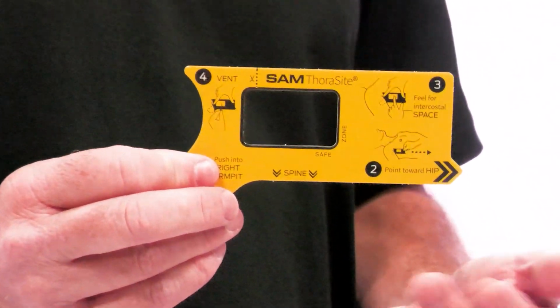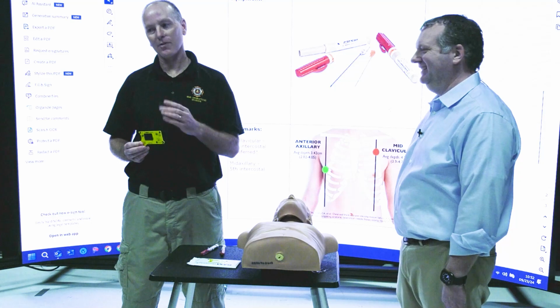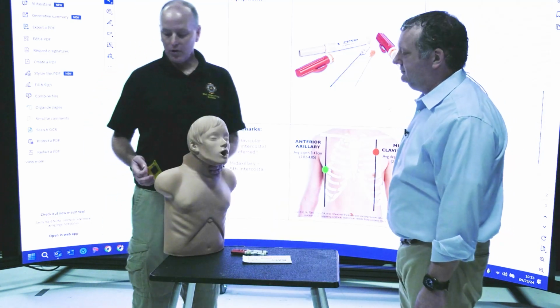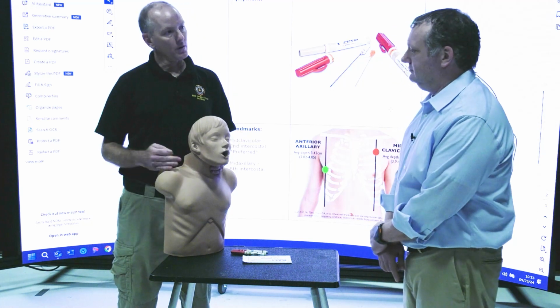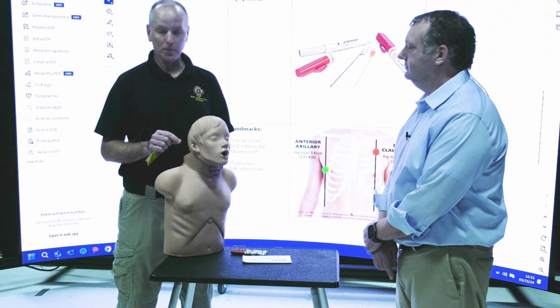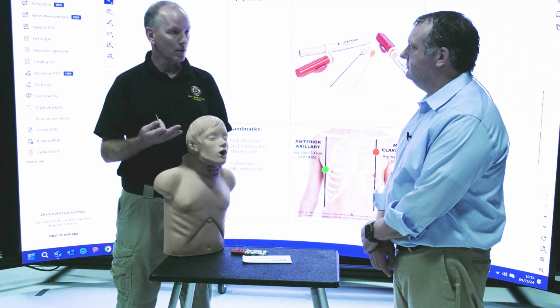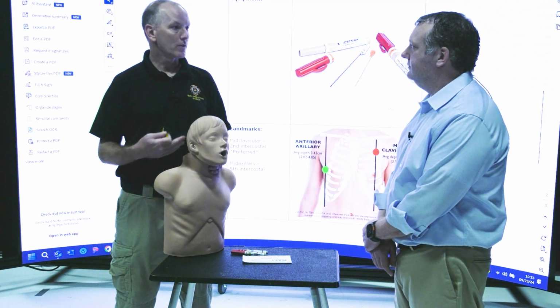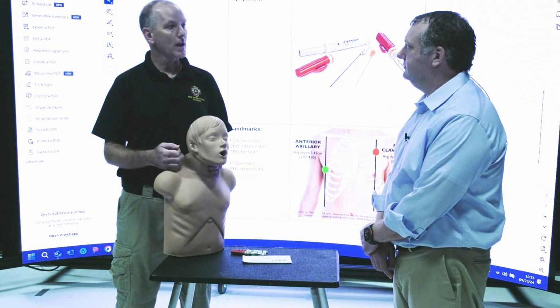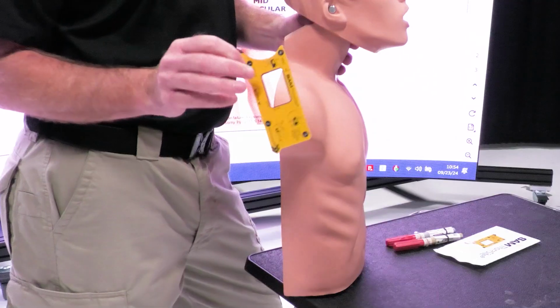We'll show you on a mannequin. We'll show you on me, not decompressing me, but we'll show you how simple it is. It's all about the hip and the armpit. So if you do decide to do the lateral approach, I know the protocol says you're going to have to document very well why you decided to do the lateral approach. So just remember that. If the patient needs it and they qualify, with JVD and completely absent breath sounds, and you cannot do midclavicular, then you're okay with the lateral. Correct. Just still got to do good documentation.